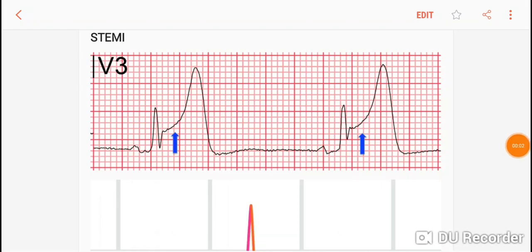Really important topic in exams and in the real world: STEMI, or ST elevation MI. In the first picture, you see these blue arrows pointing towards the ST segment that is elevated.